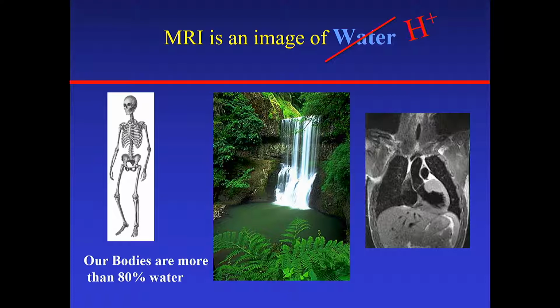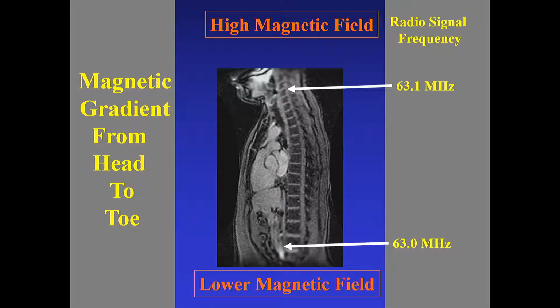So when the proton is attached to different macromolecules, it gives off a frequency, and therefore such a condition will give off a specific address or unique feature, a physical property of the tissue. And by lining up this physical property of the frequency of these specific tissues, you can differentiate whether it is in a pathologic state or normal state.